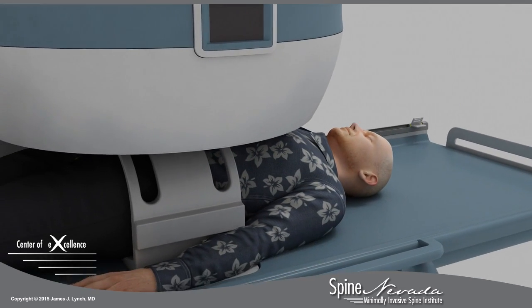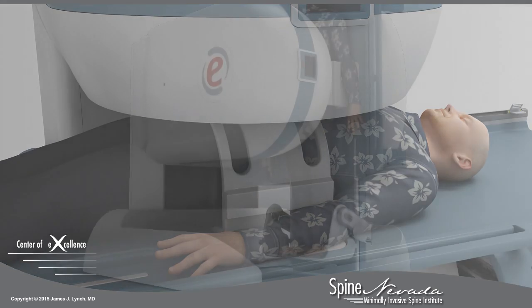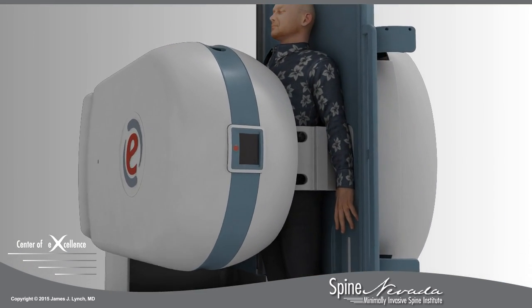The unique Esaote tiltable MRI obtains images in both the traditional horizontal position and tilts to an upright position during the same examination.